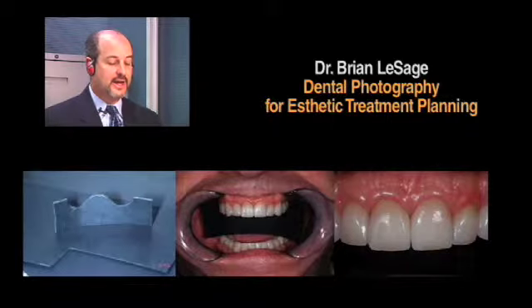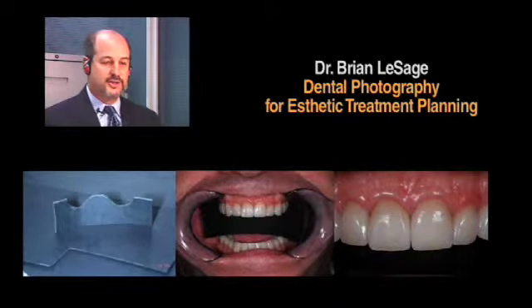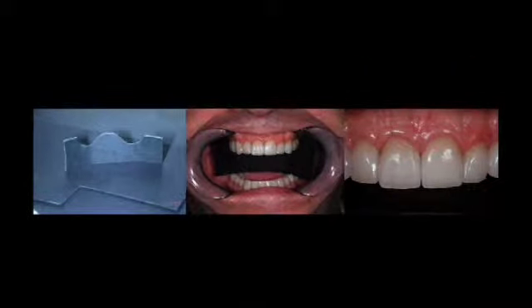And then this is something that I kind of created. You saw that PhotoMed took it to the next level, where I showed you that black background. But I like disposable things, especially if they're cheap. You can go to an art store, you might be able to find it at a hardware store, and just get this sort of crepe paper and cut this out.